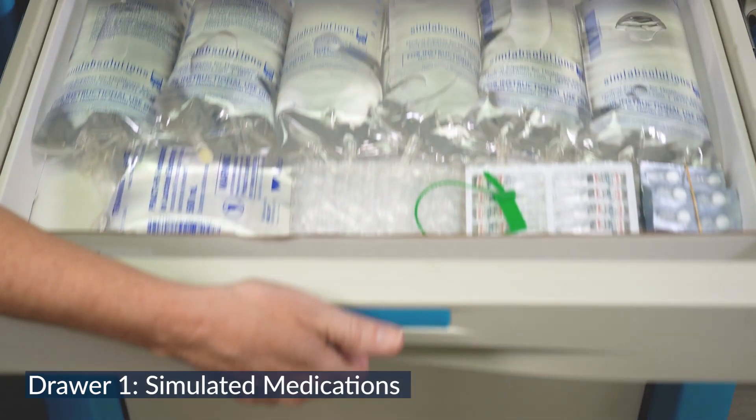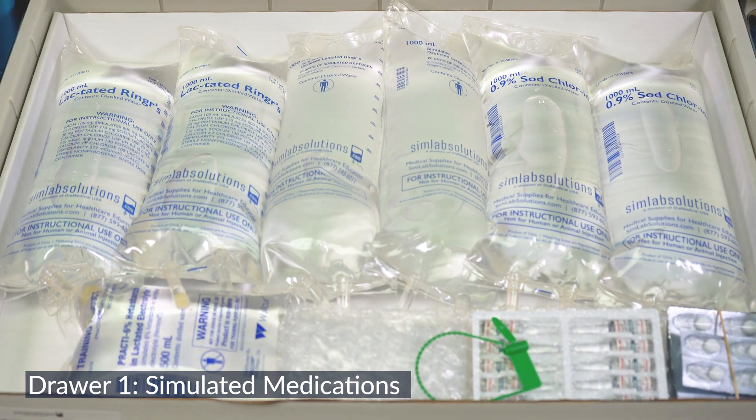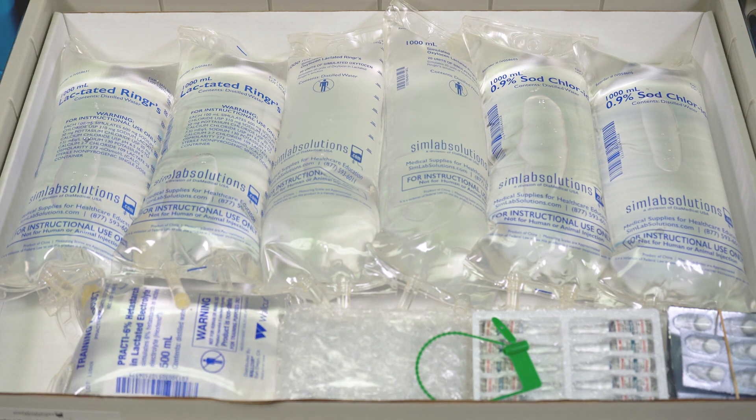Each drawer has its own use. The first drawer has simulated medications and IV fluids to treat uterine atony and hypovolemic shock. These SimRx simulated IV fluids are manufactured by SimLab Solutions.